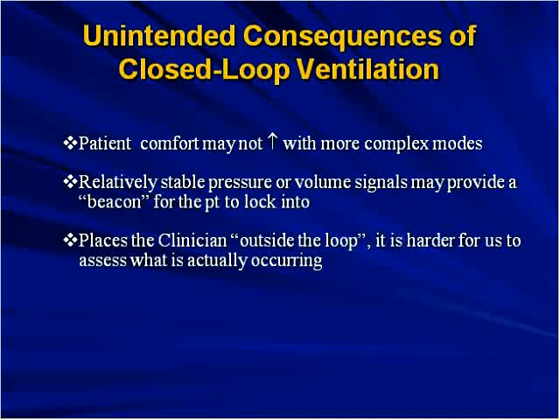Now, as soon as you stick an endotracheal tube down someone, that goes down. But the flow rate, I said a standard of 60 to 75, start out around 60, titrate to 75, is a way to kind of jump ahead and try to get control of the patient. But again, using a CPAP trial, actually measuring what the patient can do is a good way to do it. And a lot of patients, if they have muscle weakness or are really sick, can't generate very, very high peak flow rates. So again, I think you need to measure what each patient is doing.